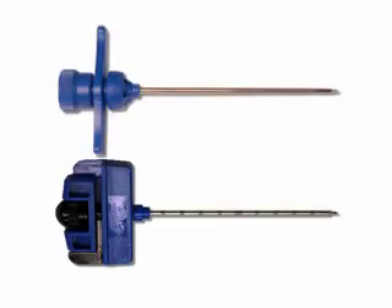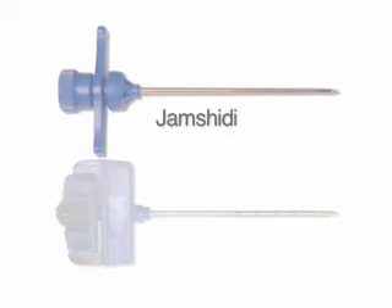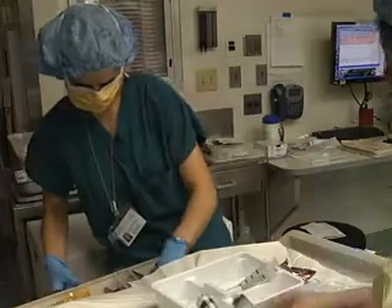Several types of bone marrow biopsy needles are commercially available. This video will demonstrate the use of the Jamshidi needle for obtaining a core biopsy. There should be an additional team member present responsible for immediate preparation of specimens.